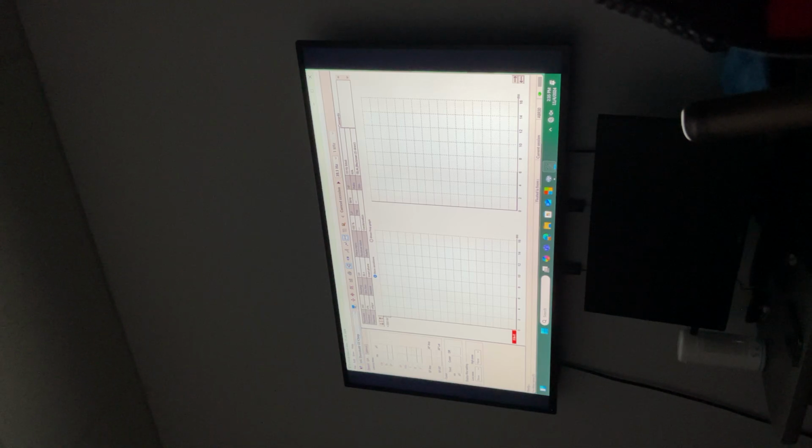So now I go to narrowband here. So for this week's lab, it's 4,000 and 2,000 hertz. The same 39.1, 30 to 1500, the rest is the same. Let's go 70 dB. Let's directly go to 30. Okay, because 70 was so big.